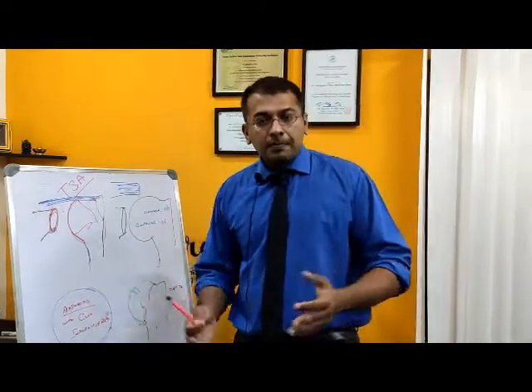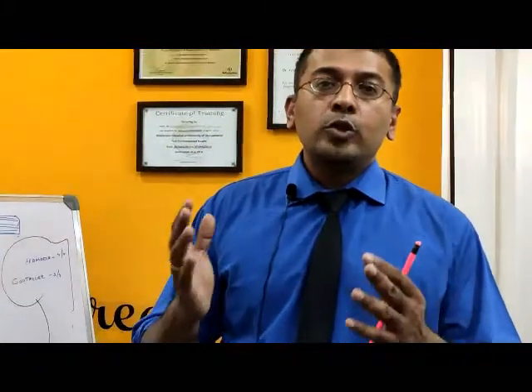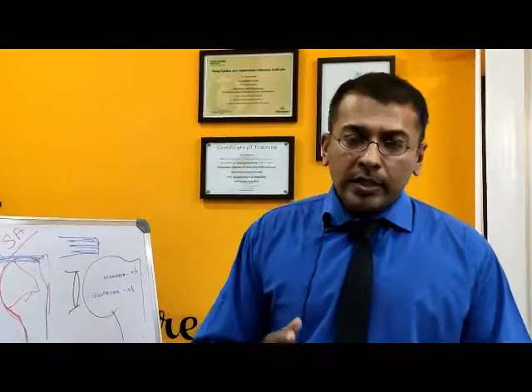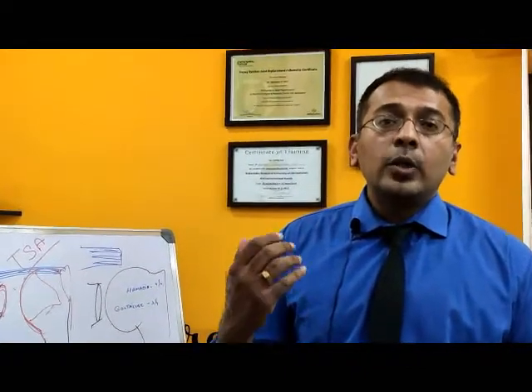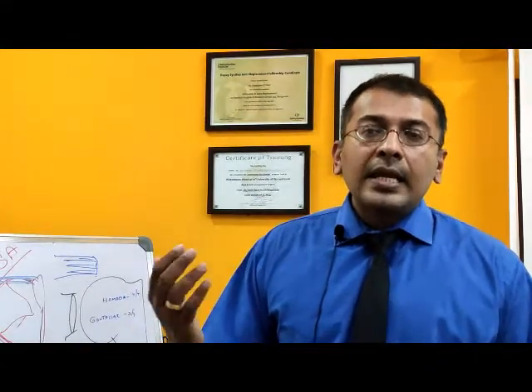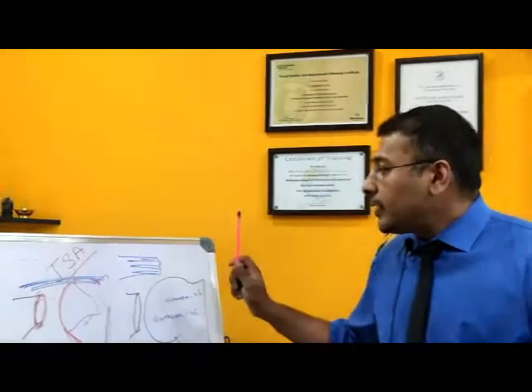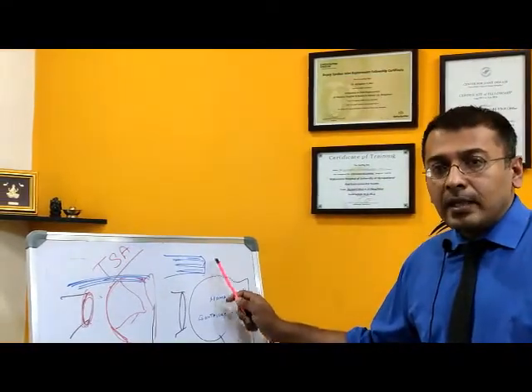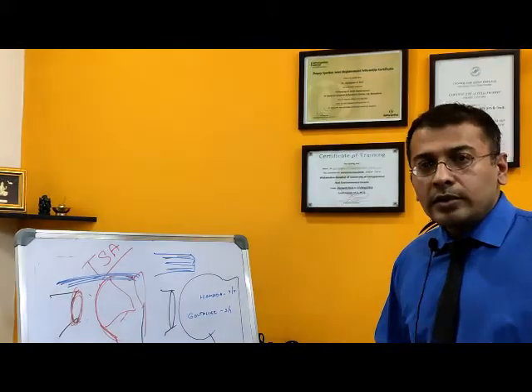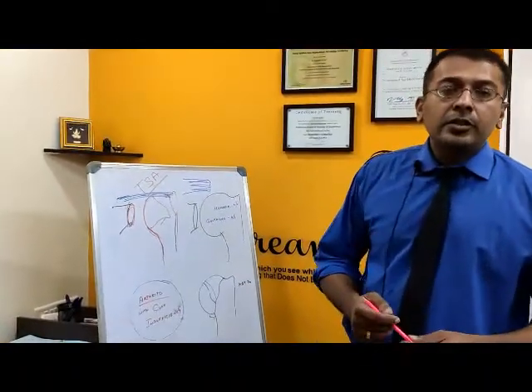To sum it up, shoulder replacement is of two types: total shoulder replacement and reverse shoulder replacement. Total shoulder is done in arthritis where the rotator cuff muscle is intact. The reverse shoulder is done in severe arthritis where the cuff is not there. It is also done in massive irreparable muscle tears with certain criteria, arthritic criteria showing severe arthritis, and also in unstable fractures of the shoulder.